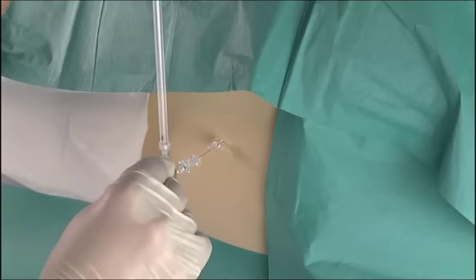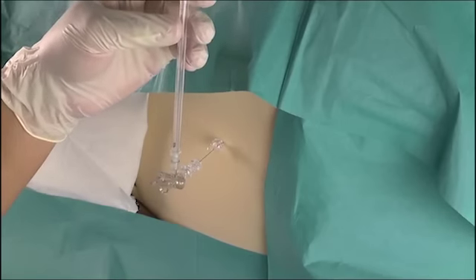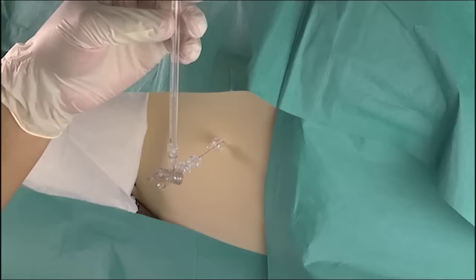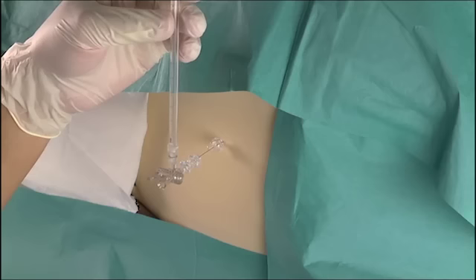The first thing to do is to attach a cerebrospinal fluid manometer to determine the opening pressure. Make sure that the three-way tap is appropriately assigned before connecting. Wait for the cerebrospinal fluid to rise through the manometer until it is equilibrated. It is normal for there to be some fluctuation with respiration.